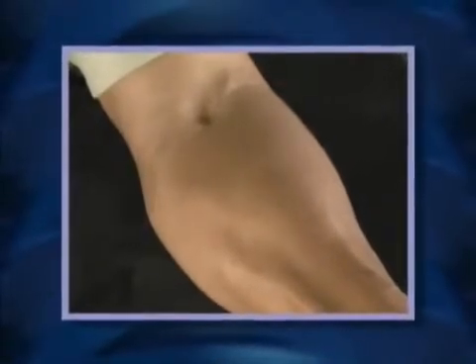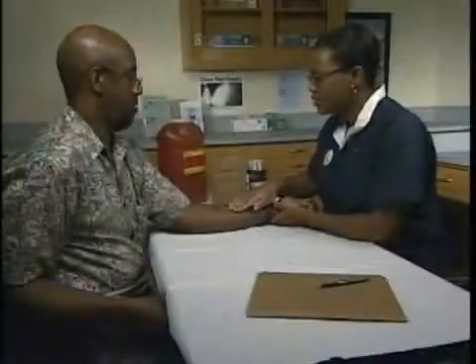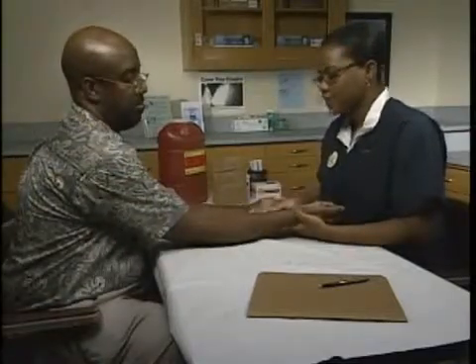The area selected should be free of any barriers to placing and reading the skin test, such as muscle margins, heavy hair, veins, sores, or scars. If the patient has any of these at the site, then you should use the other arm, or the standard alternative site selected by your institution.